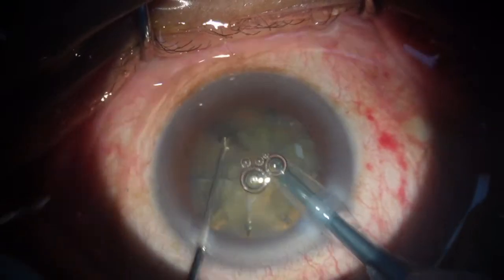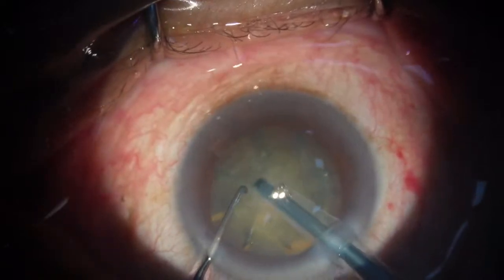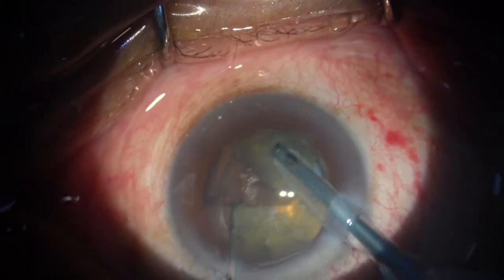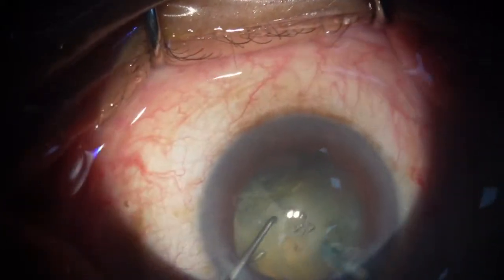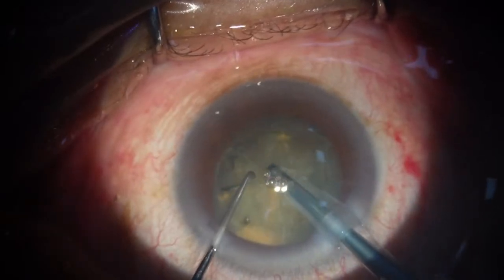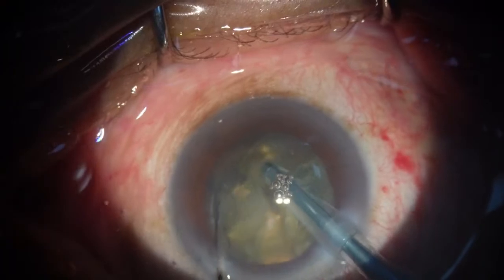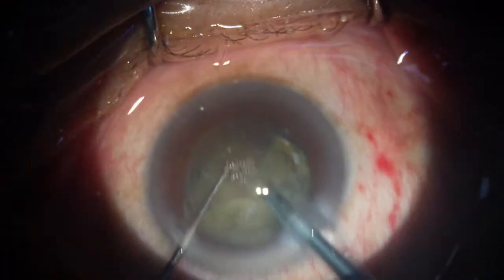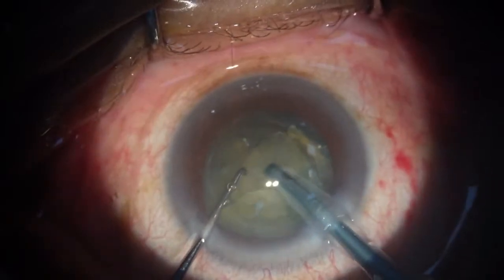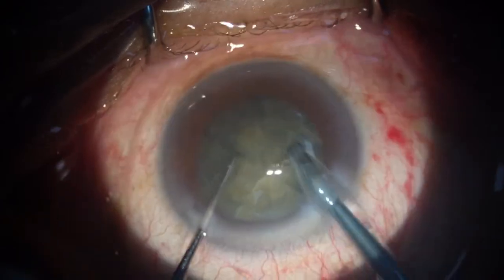Along the cleavage planes, I'm just separating them. Here, one. While chopping, I have to make sure that I'm rotating them so that they're in the right opposite. But here I can go ahead and do 2, 3 chops together. So just going into the octants which I had made. So these are the laser. All these pieces are getting separated.